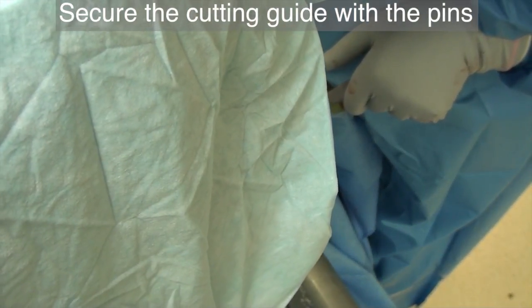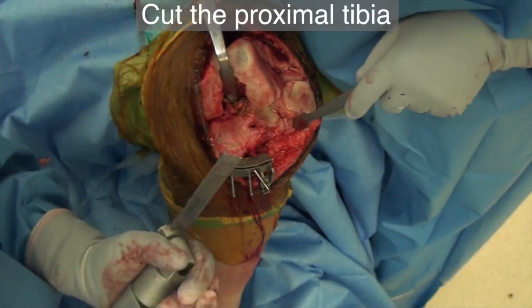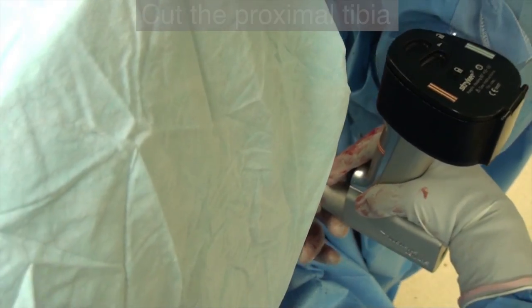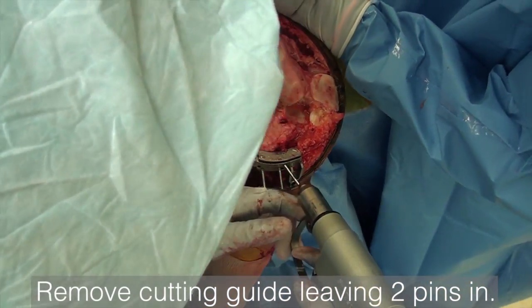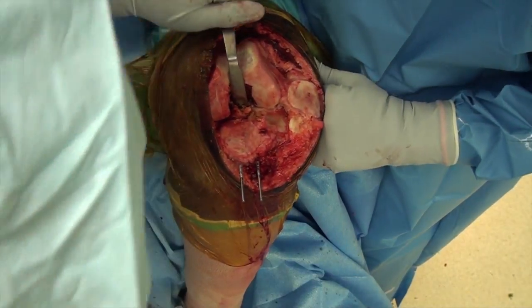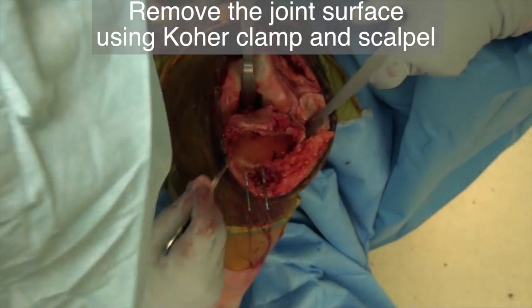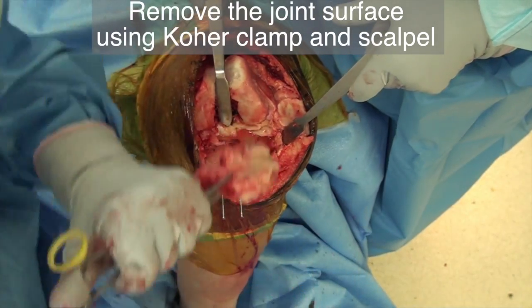Once the cutting guide is in place, remove the rest of the alignment guides. Cut and remove the tibial joint surface with the oscillating saw. Once the cut is completed, remove the cross pin and the cutting guide, leaving the two parallel pins in place — you will need them in case you need to recut the tibial plateau. As you cut through the soft tissues in the posterior aspect of the knee, make sure to point the blade of the knife down towards the cut tibial surface and not towards the back of the knee.